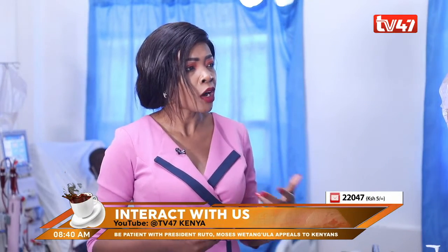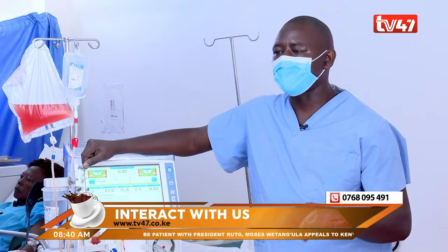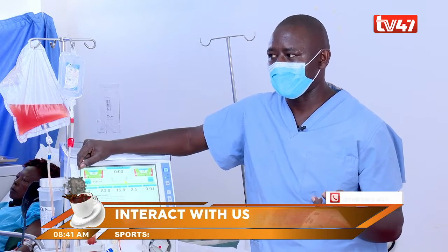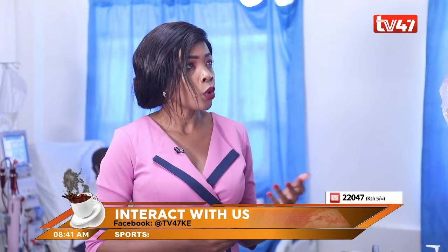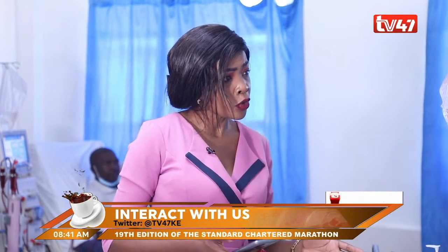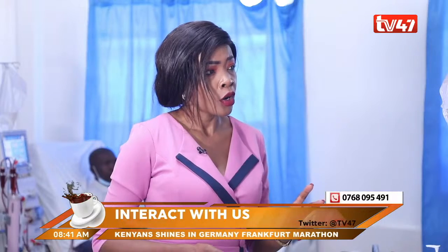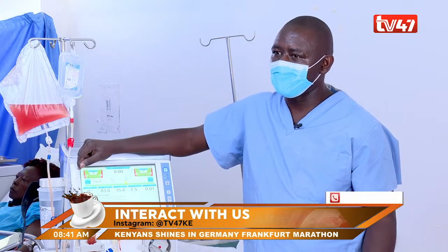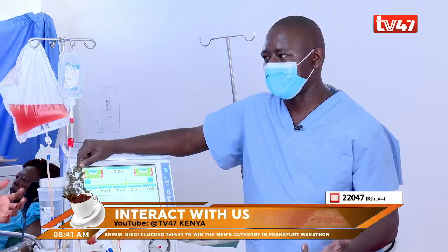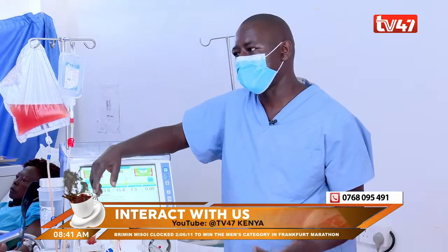How often does one need dialysis? Most of our patients who are doing dialysis are using their NHIF card, and the NHIF card provides for two sessions per week. We recommend three sessions per week, but because of financial issues, we do two. How long does a session take? It takes four to six hours. This keeps the patients going — they sustain themselves and do their normal duties.